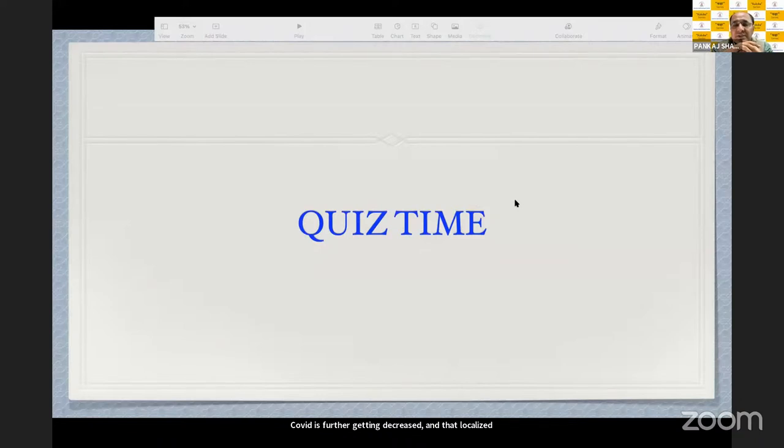The thickness or thinness is in no way related to the power of the cornea. And the last question is a follow-up to that. It's a good question. If you have a thin cornea, as some of the residents will realize, and in a tangential map there is flattening in that area, what could it be? A thin cornea with flattening.